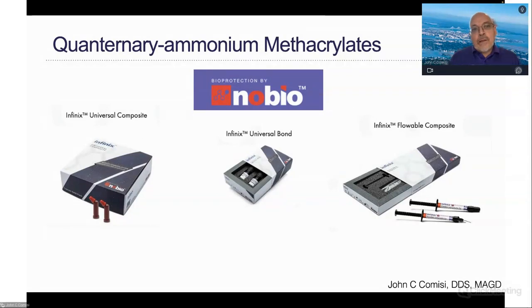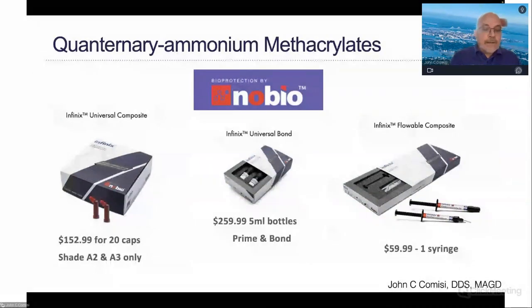But if you take a look at the company's website, you start to look at cost. And unfortunately, the cost for these materials is quite high, and the shade selection is very limited. And that's something that you as a clinician may take into account as you're working with it. But this might be a possible solution to what needs to be done or what is trying to be done.